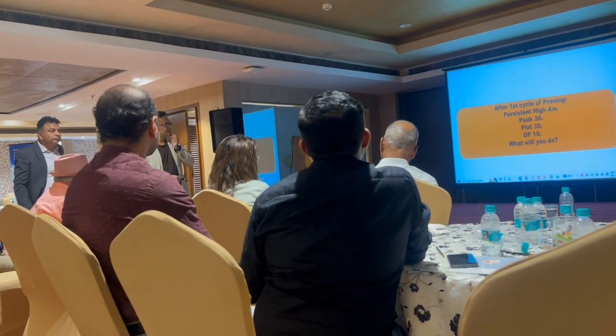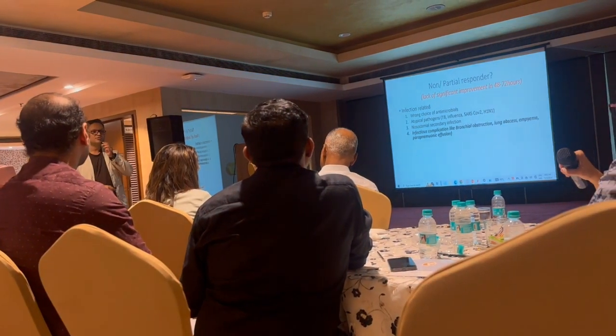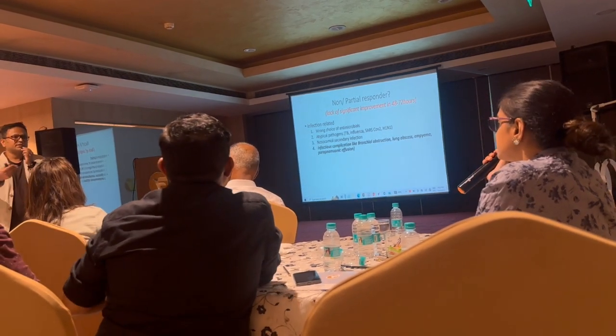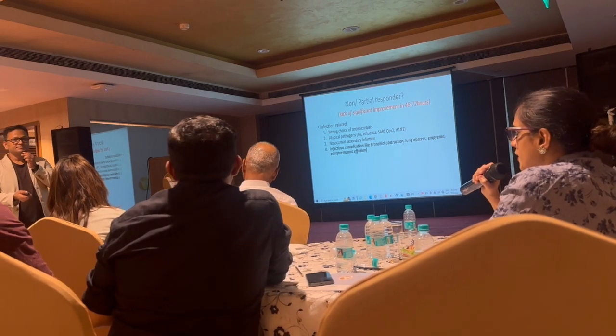ECMO is one. What else? Can you see the peak airway pressures are still on the high side? Still continue. Yeah, who said you? Yeah, we have to continue. I'm not denying proning, but proning is not helping you in terms of the targets which you want to achieve. Superadded infections we have to look for. Any superadded infections.